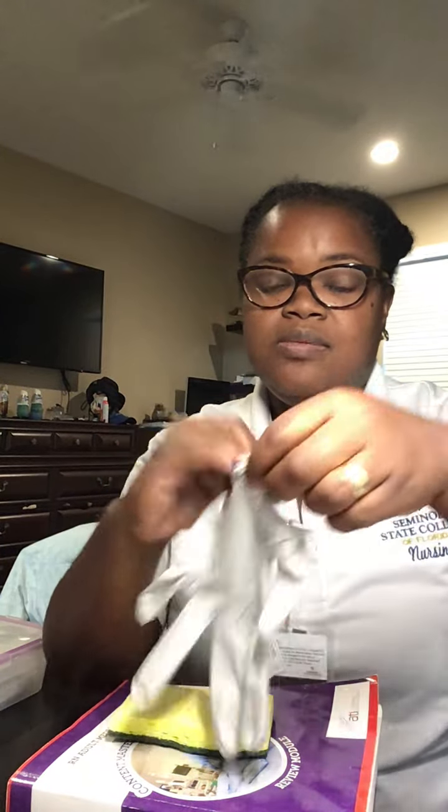Before I start the injections, I'm going to assess. I'm going to do an assessment like a blood pressure, whatever can indicate to me that the patient is not going to have something abnormal or unexpected after the injections. Okay, now let me wash my hands again. Let me put on my gloves.